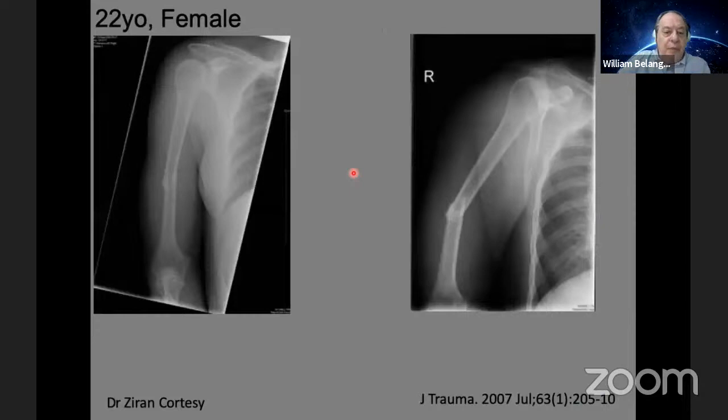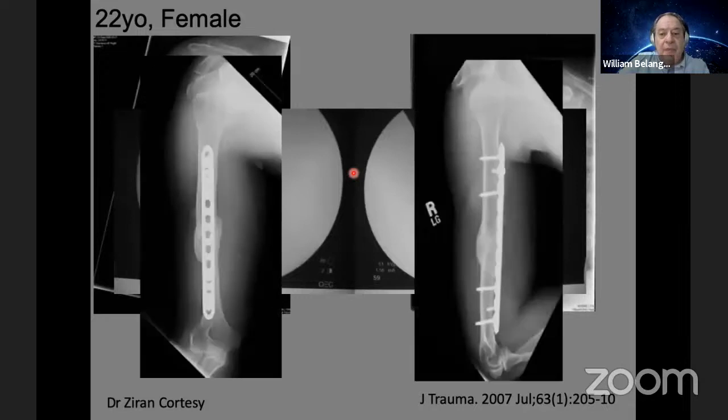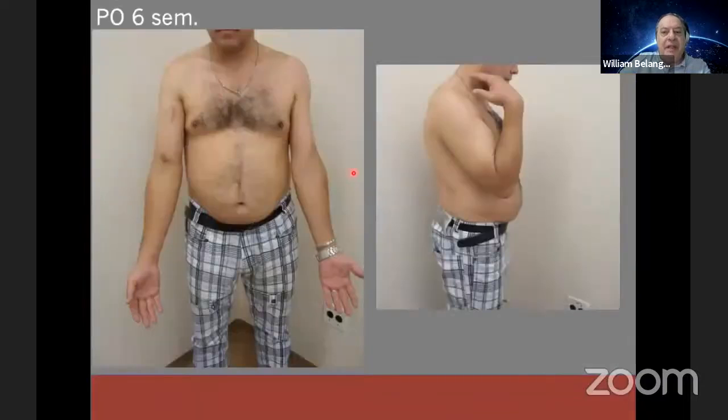Let's see an example. This is a case. You see the cortical screws, unicortical screws, and 2 locking screws, and a very beautiful callus. After surgery, we start as soon as possible active movement and rehabilitation, total rehabilitation, elbow and shoulder. And the patient after 6 weeks.